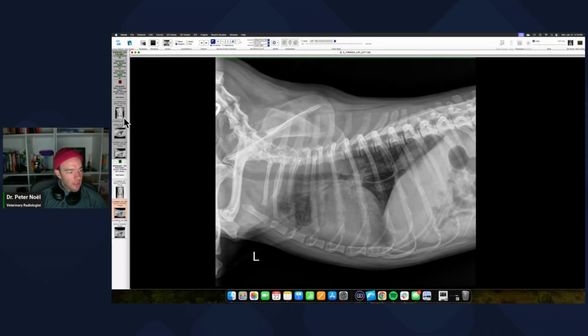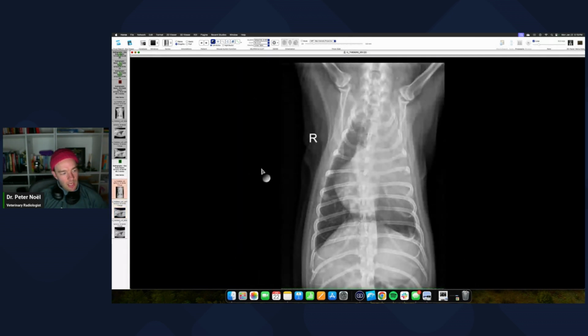This was the following day. Okay, so I wonder if this dog came in a little after lunch over the summer. So it was a lung lobe mass. I wonder if this came in, they looked at it, they go, I wonder if this is pneumonia. So then they treated the dog overnight, and it was hospitalized overnight, but you'll see that over here the next day it came in, and then let's see what happened.